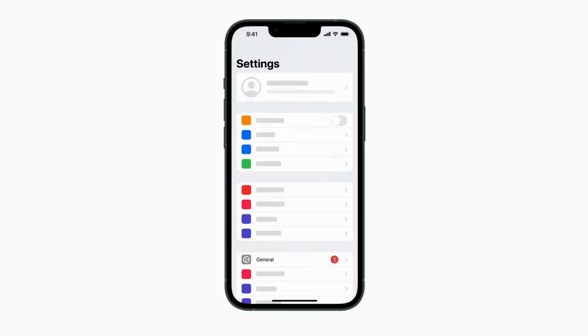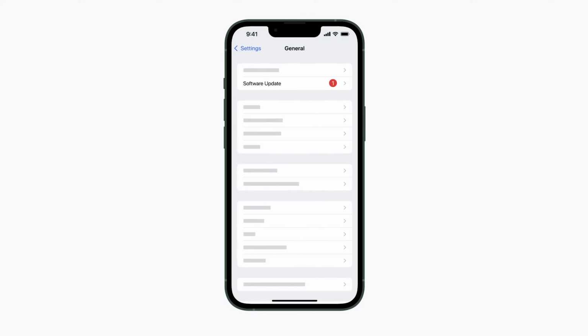Software updates are always located within the settings menu on your phone, so go take a look and make sure that you're running on the latest and greatest. This is true for hearing aid apps as well, so make sure that you're periodically checking to make sure that your hearing aid app doesn't need updating too.